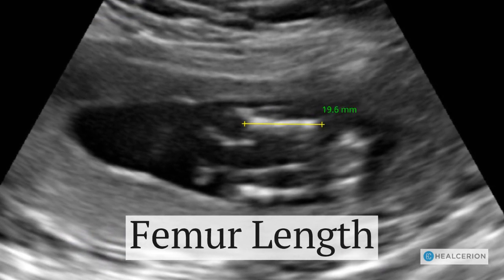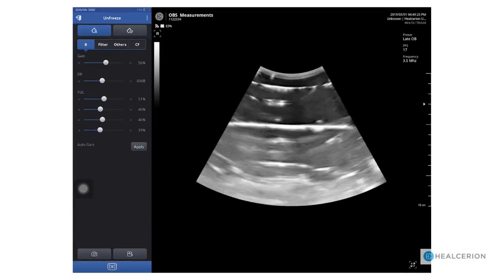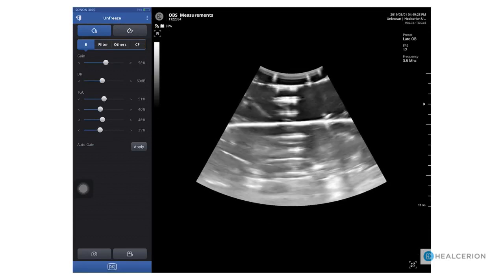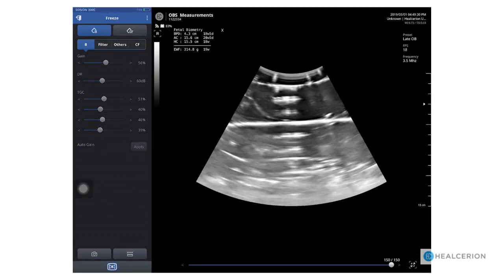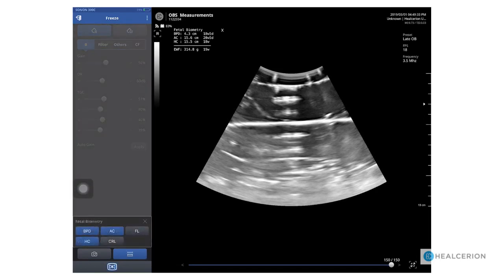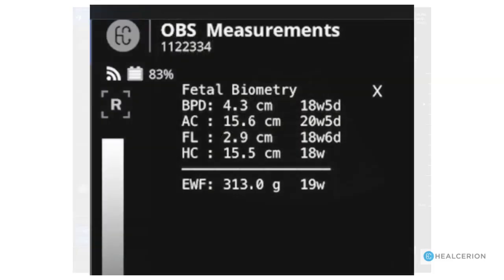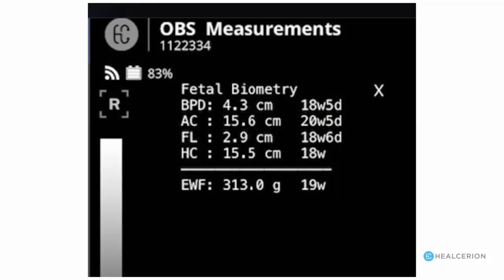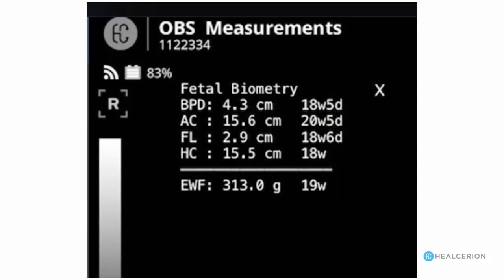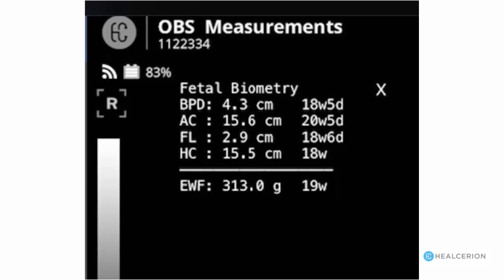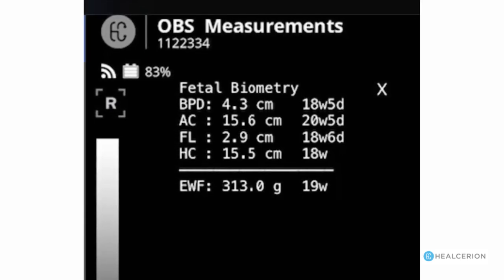The last parameter to measure is the femur length. Again we're using a phantom. Scan to achieve the correct positioning for femur length. Open the OB menu and choose FL for femur length. Notice during the exam once the measurements are performed the icon turns blue to show that it's been done. Now we have all the measurements complete for this exam. Here's a look at the fetal biometry menu that's been populated showing all of the measurements, the estimated fetal weight, and the fetal age.